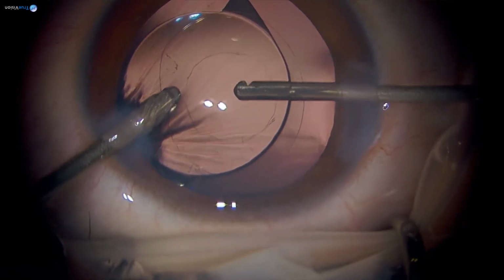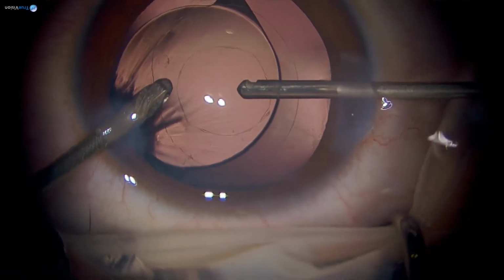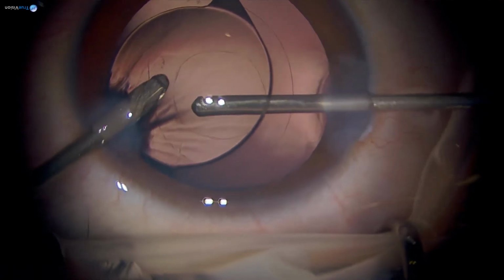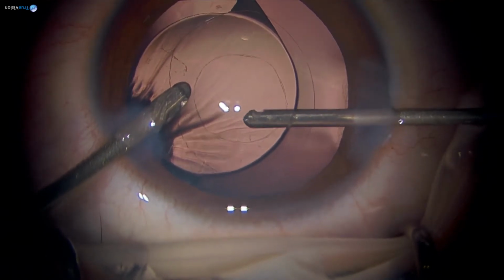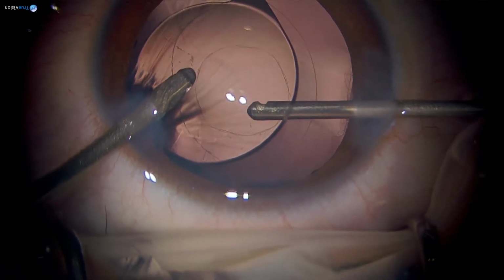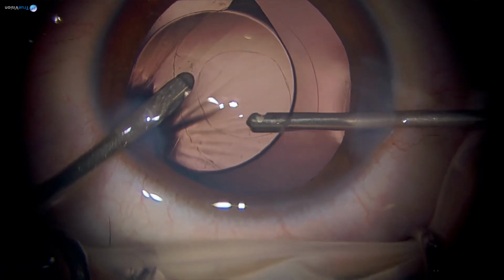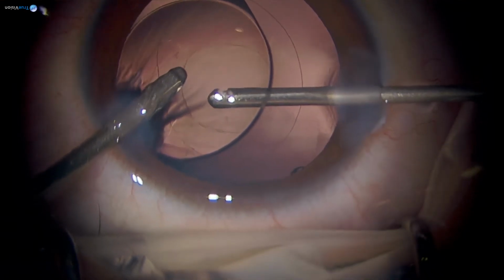Now you can see I'm almost reaching the end point. I'm at 3000 here. Your posterior capsule should not flap because there should not be any capsule strands coming in between. So this is almost the end of that.